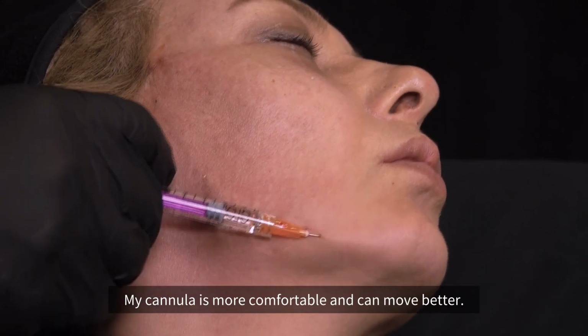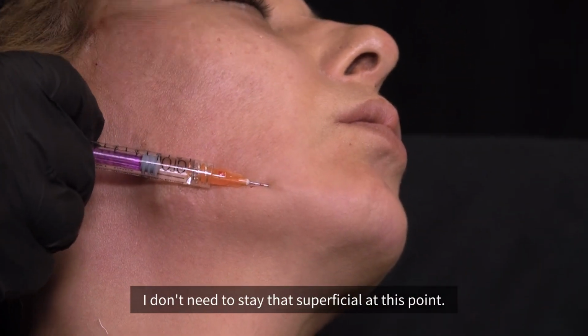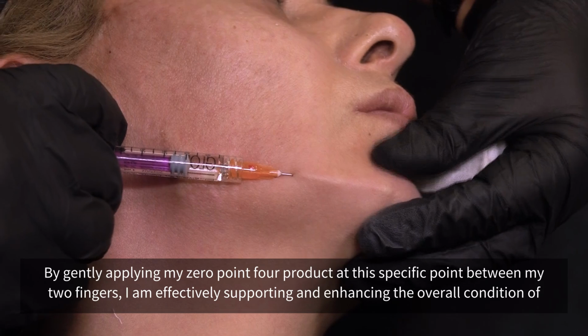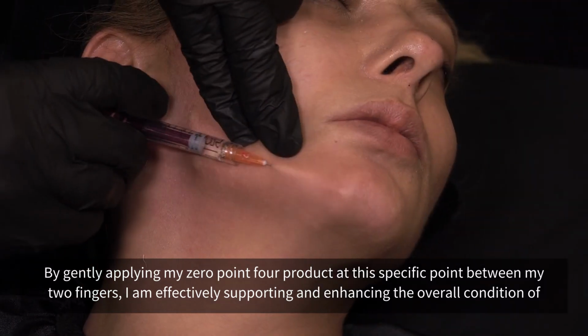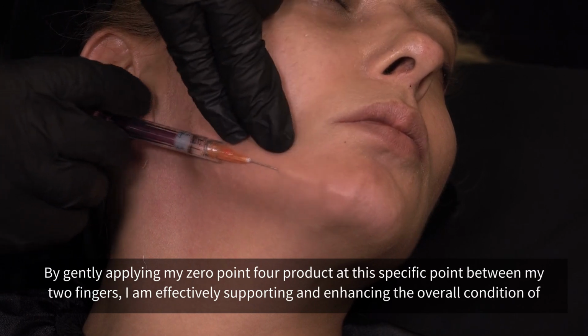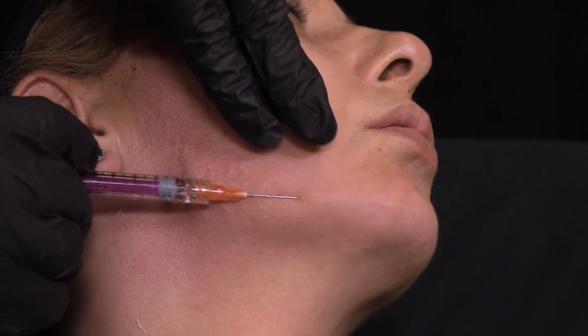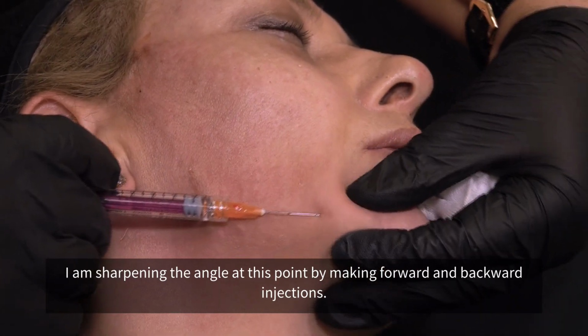My cannula is more comfortable and can move better. I don't need to stay that superficial at this point because I'm not defining a new angle. I'm a bit deeper into the fat tissue. By gently applying my 0.4 product at this specific point between my 2 fingers, I am supporting and enhancing the overall condition of this area for optimal results. I am sharpening the angle at this point by making forward and backward injections.